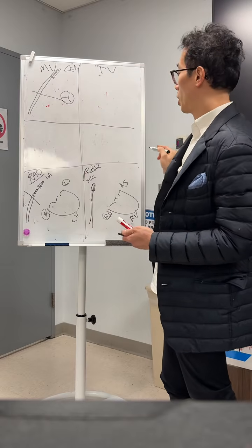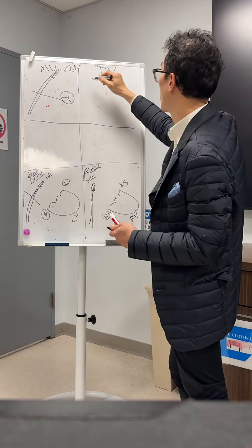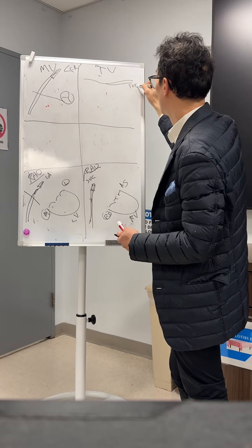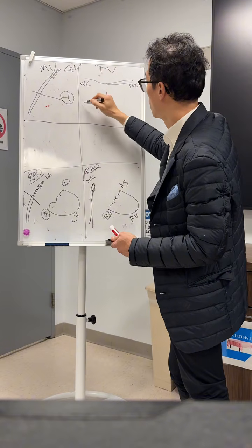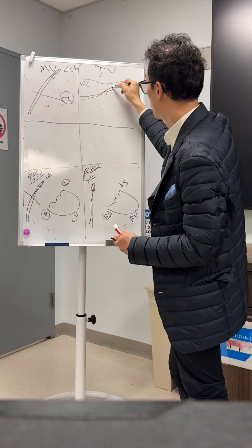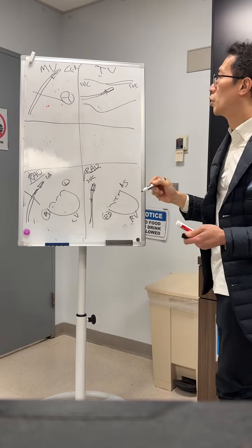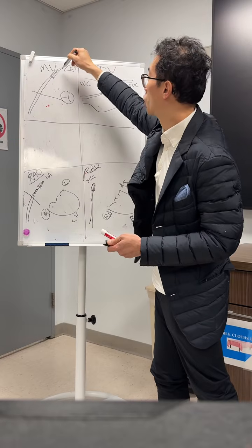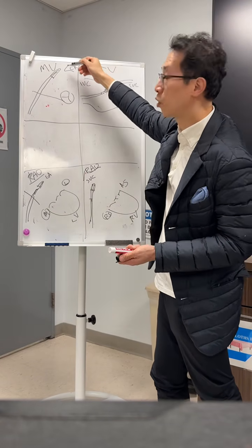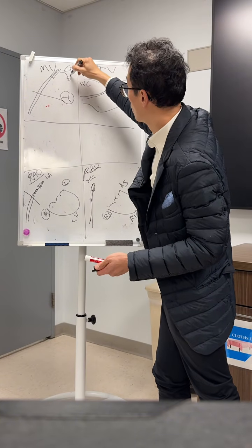So on the tricuspid side, there'll be the bicaval view. This is a septum, this is SVC, this is IVC. The device is straddled already right here. So what we need to show is that you need to clear the Coumadin ridge so you don't end up causing trauma to it. So you will start aiming.